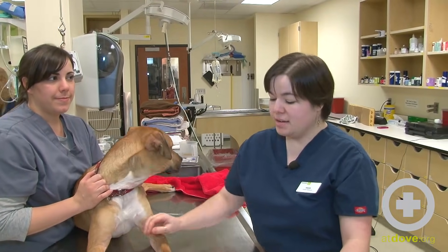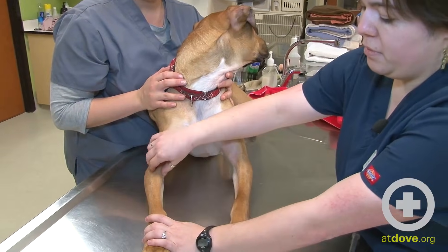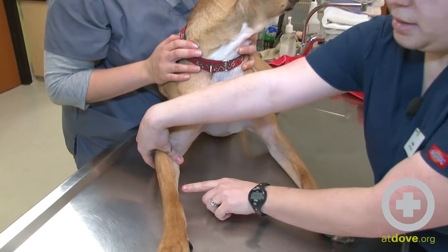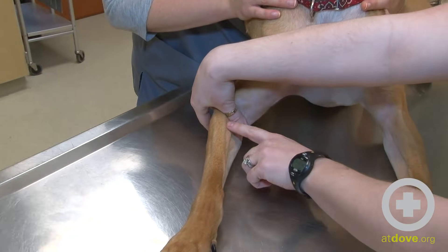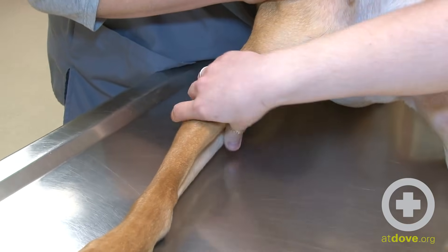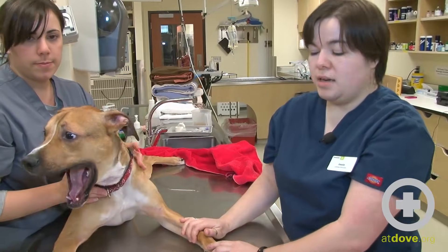Hi, I'm Joni and today we're going to talk about how to draw blood from a cephalic vein. The cephalic veins run along the top of the forelegs. You can see them in this dog here, right there. We usually try to reserve these veins for IV catheters, but in some patients we'll use those veins.